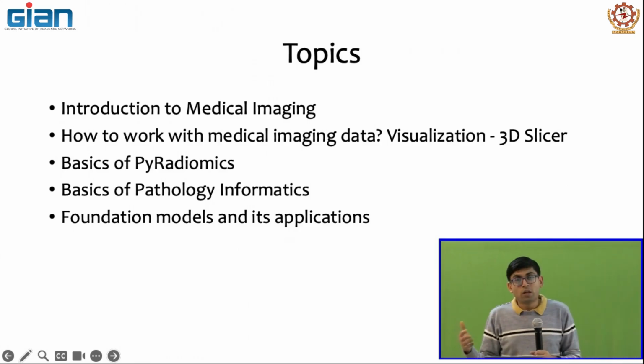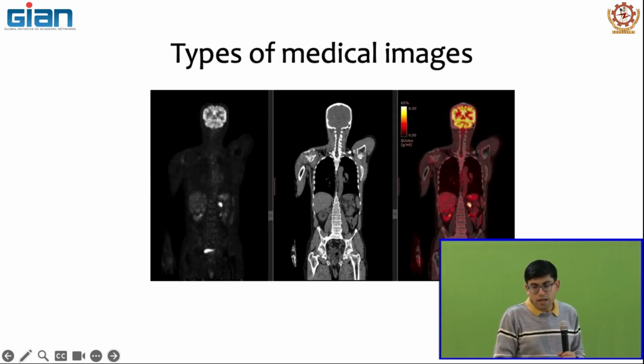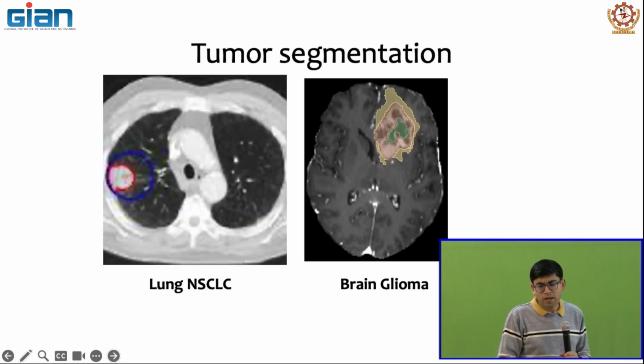Most likely it will not. It'll work in the sense that it'll give you some results, but it might not be the best results. Usually, foundation models are fine-tuned further for your own purposes. So with that, these are other kinds of images like PET images.